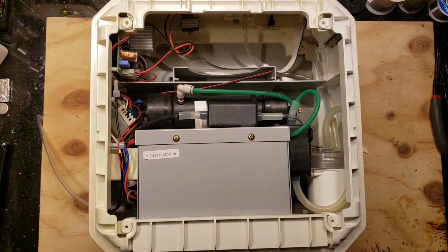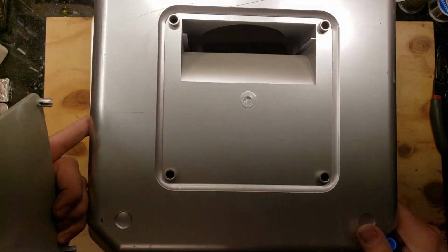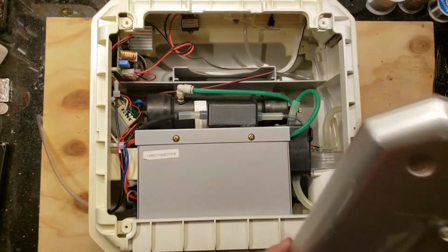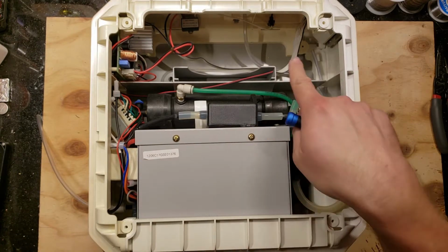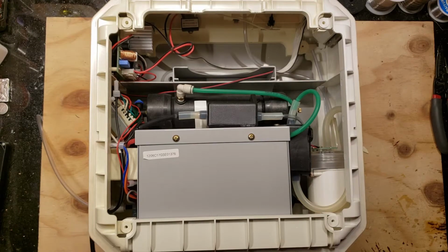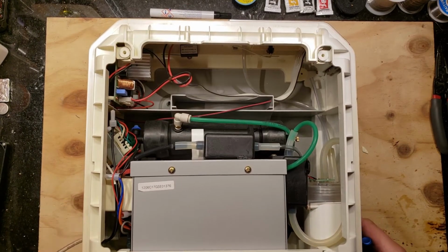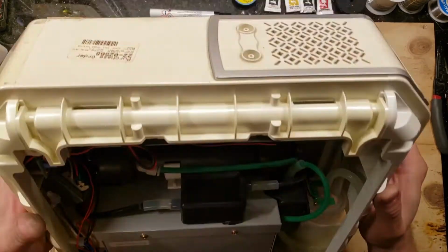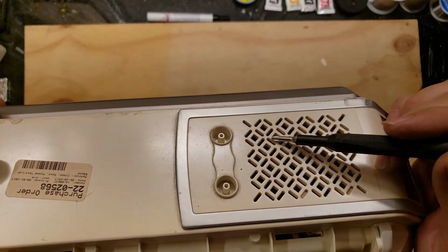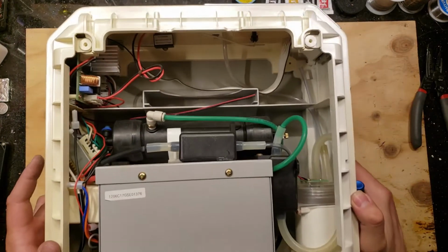This is the cover. This actually also comes off, and apparently this has the capability of having a filter right here, which doesn't really do anything if you put it in there, because there's a bunch of open spots throughout the machine that would basically negate it. Also, a funny thing, there's this little thing called Anion Generator out there, and it's just outputting something right here rather than to one of the hoses. And it looks like one of the hose spots is disconnected internally.